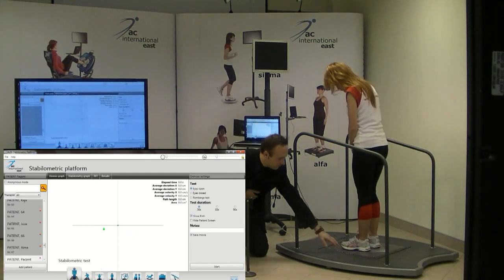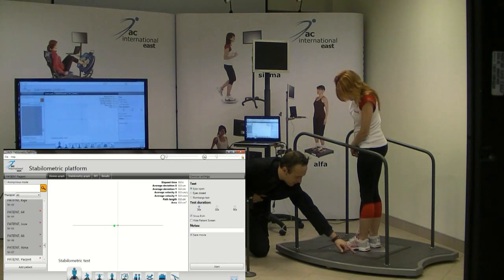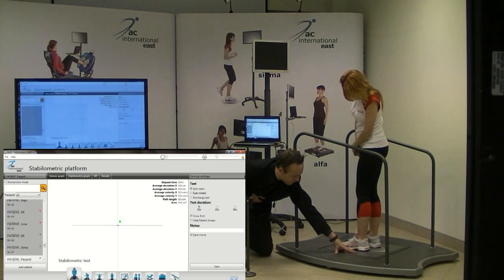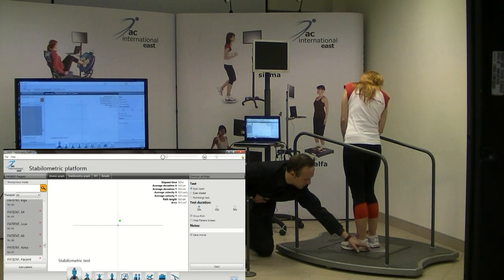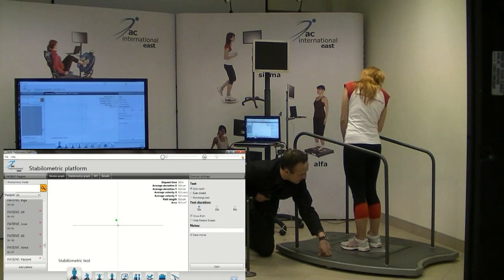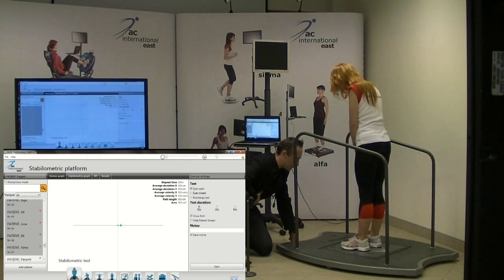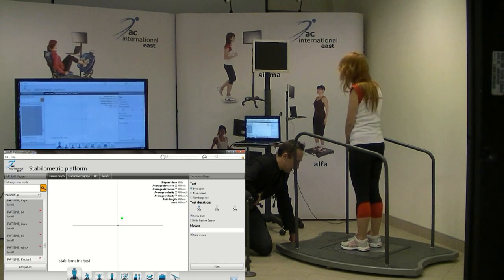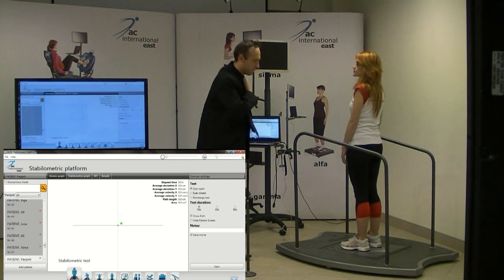Okay, first of all, the center of the lateral malleolus should be on the red line. Then we look for the position of the calcaneal tuberosity, okay? So here we have the position of F4 for the left and the right lower extremities, and then the position of the medial part of the foot. So here we will have 10 degrees, okay? So this is your position for the test.